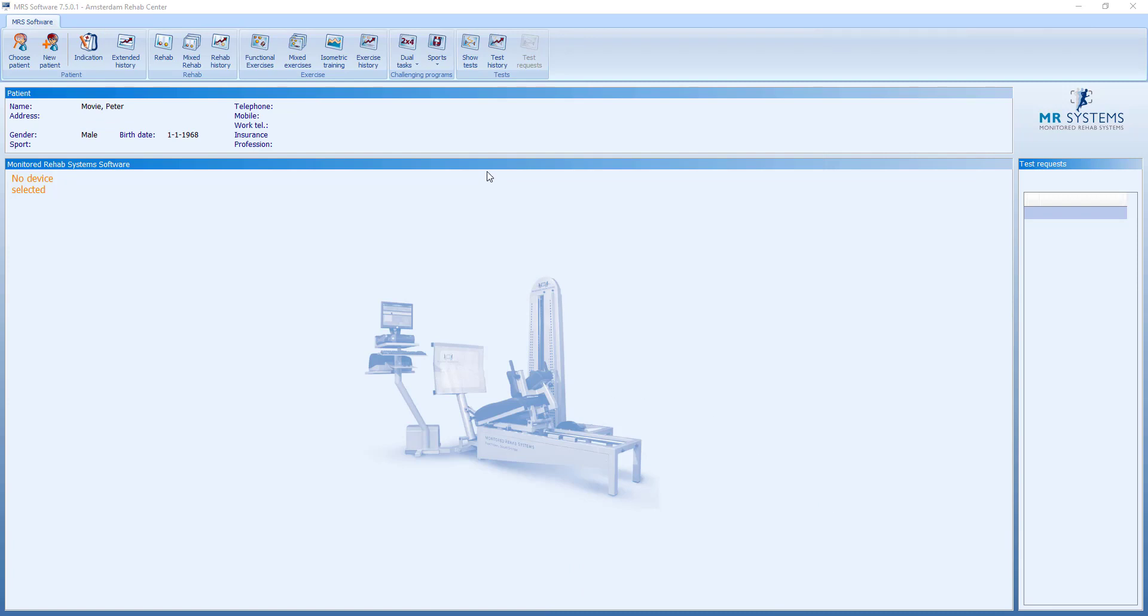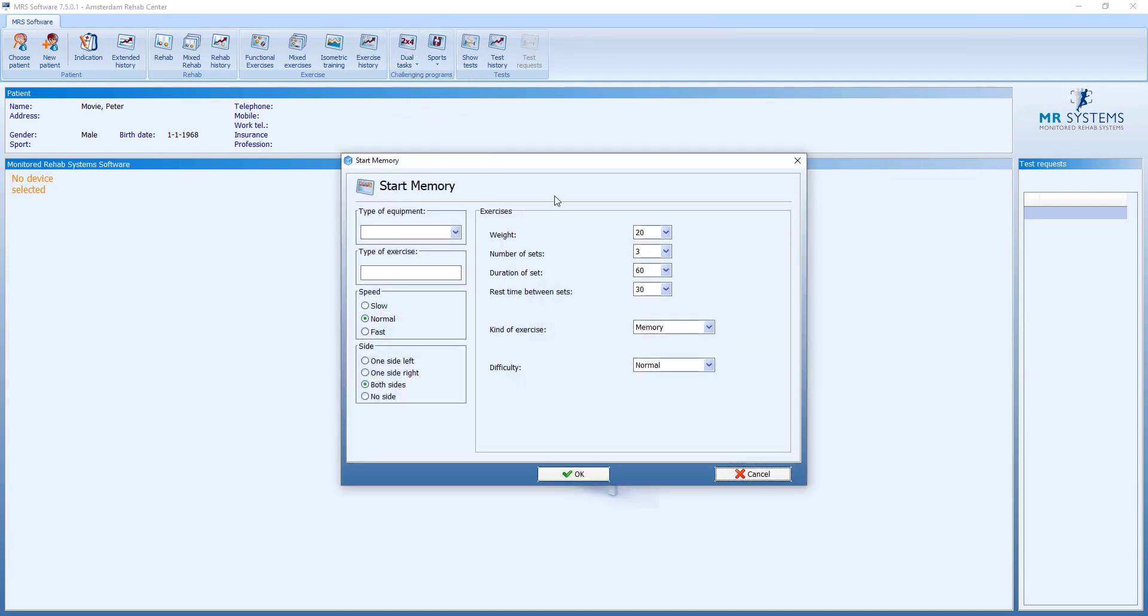Our last dual task exercise is the memory. Also, this one is useful for people with motor control issues or neuromotor disorders. Same menu where we can decide what the exercise should do.